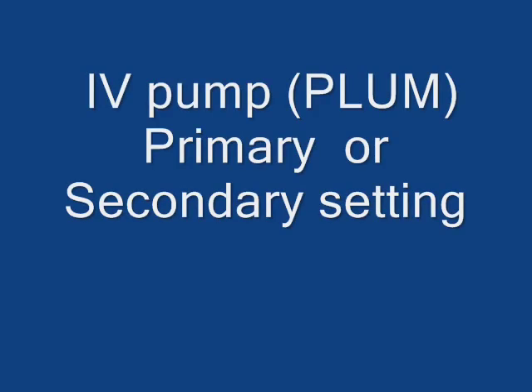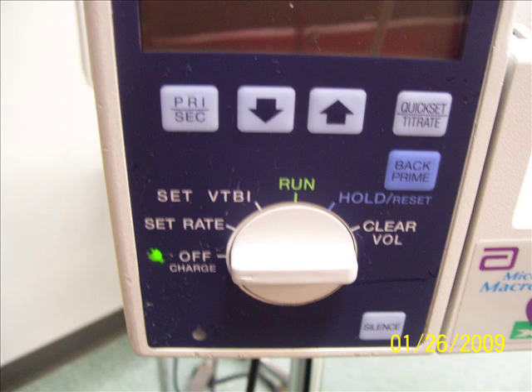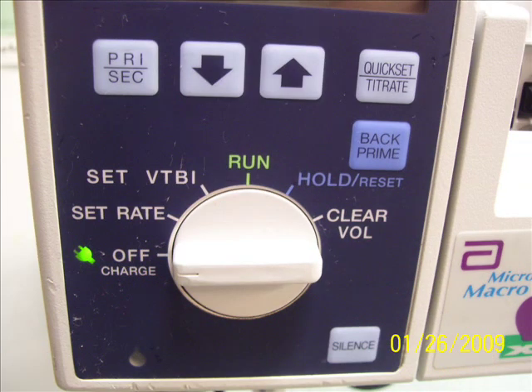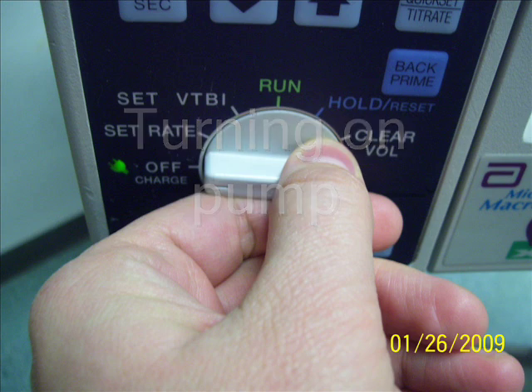Hi, this is an introduction to the IV Plum setting and priming the primary line. It's the same as the secondary setting, just the difference between those primary and secondary buttons that we have there.